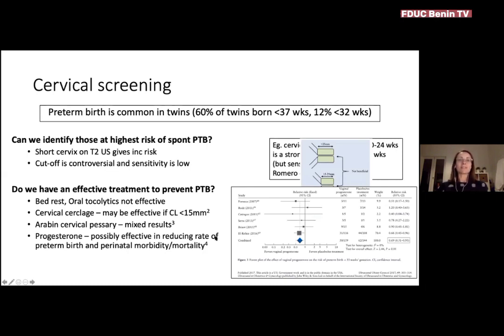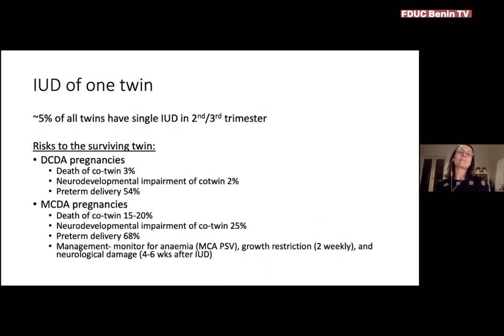So in the absence of many treatment options, we don't really know if it's useful to measure the cervix or not. And so in Australia, there are certainly very mixed practices, and some places would measure the cervical length routinely and other places wouldn't. And you can always tell if there's not good evidence for a particular practice because everybody does something different. So I think the jury's still out on whether we should be using that in the second trimester in twins or not.